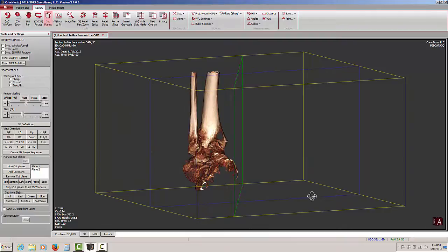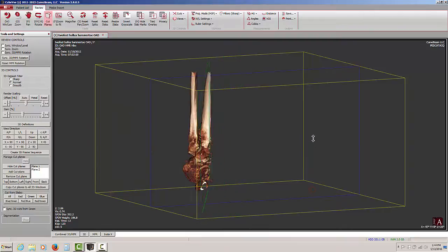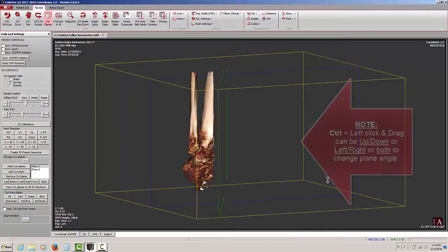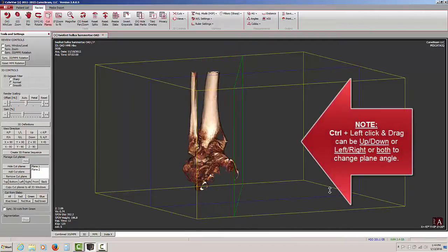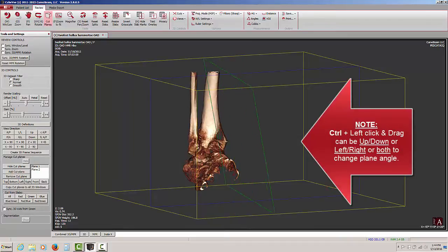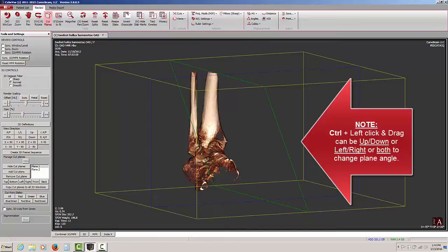Again, shift, left click, and drag moves your cut plane or shifts your cut plane. Control, left click, and drag will change the angle of orientation of the cut plane.